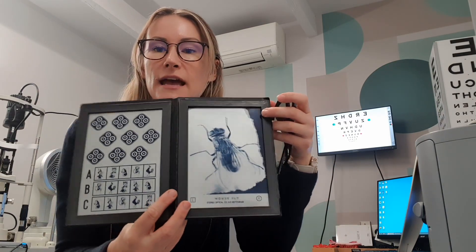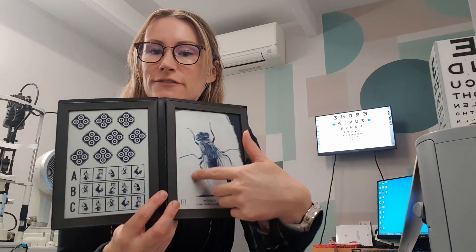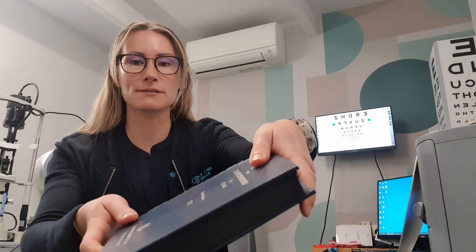We also check the stereopsis, which is the ability to see in 3D. With the use of these 3D glasses and this test here, if the child has good 3D vision, they'll see the wings of the fly sticking out. They'll also see one of these animals sticking out of the page, and one of these circles on each of these sets here. If a child has poor stereopsis, it can be a sign that they have a lazy eye, or it can also just be a sign of weakness in their binocular vision system, perhaps trouble focusing.